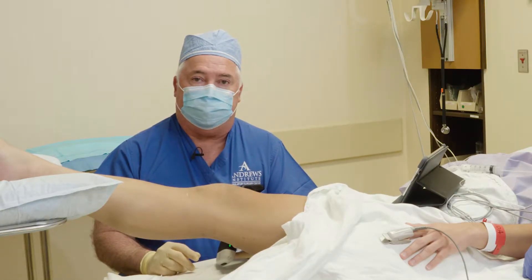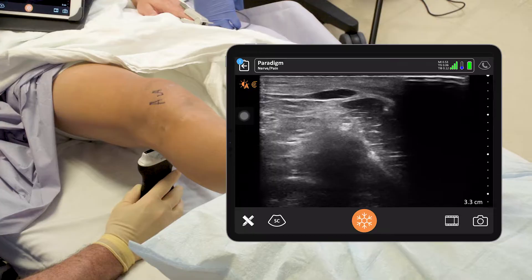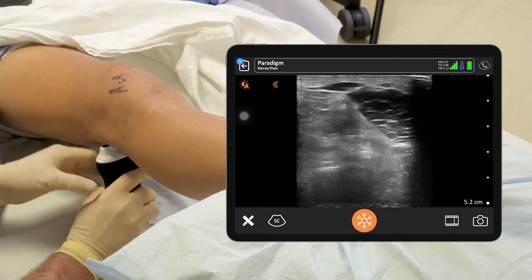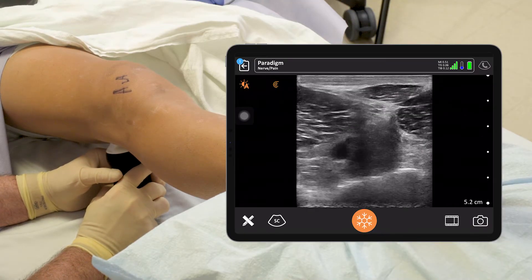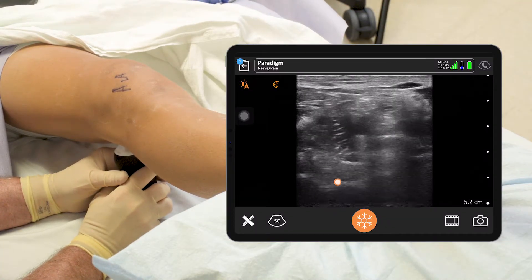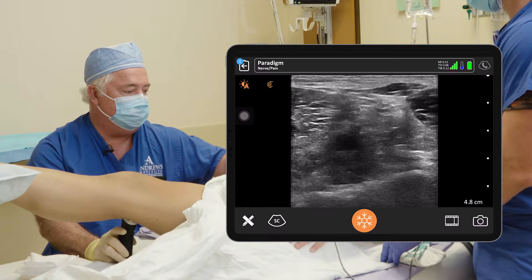We're going to start with the IPAC injection, beginning posteriorly. We need a lot of depth, so all I've got to do is swipe my finger up like this to add some depth to our image and a little gain. I've got to put a little pressure on here. Here we can see the artery — go down just a little distal and we should see the condyles, and we want to be just above that. I'm going to decrease the depth just a touch here.